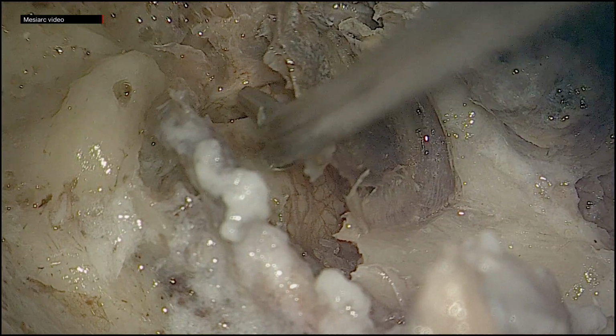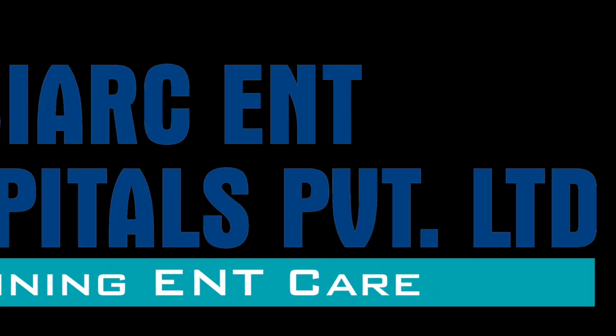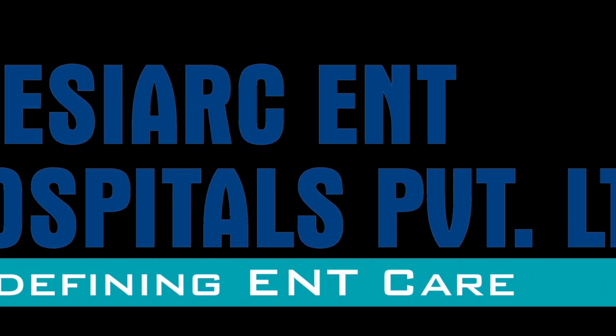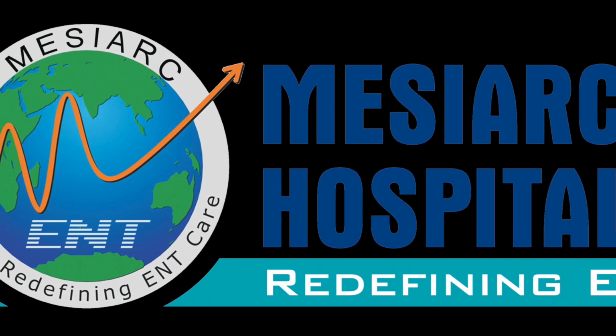Ossiculoplasty at this level can be done by making a vertical strut of either cartilage or the incus. The incus is being shown here. You have to create a groove and a portion which lies on the footplate. So here the incus is placed on the footplate and the groove is placed underneath the handle of the malleus. This completes a canal wall down mastoidectomy in a patient who does not have an intact stapes.